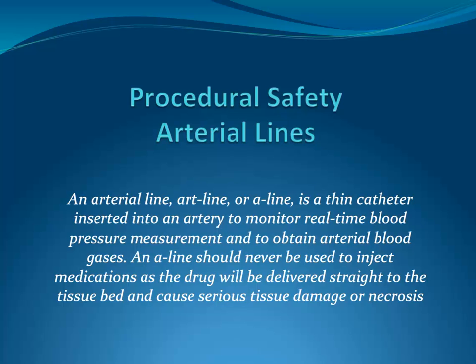An A-line should never be used for injectable medications, as the drugs will be delivered straight to the tissue bed, potentially leading to serious tissue damage or necrosis. All A-lines should be carefully labeled to avoid this.